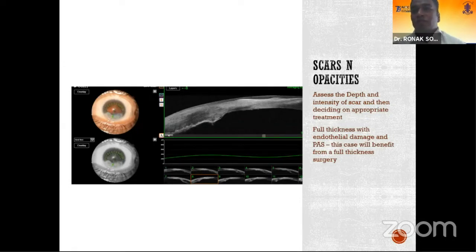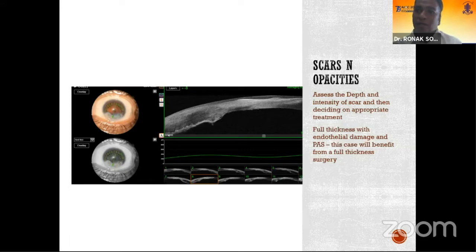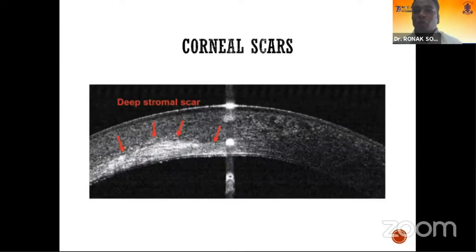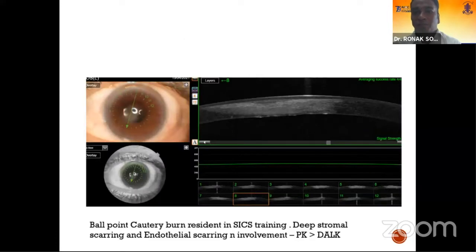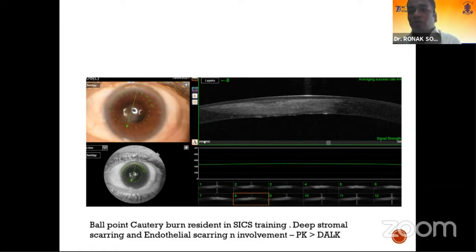For example, in this case you can see there is a full-thickness scar with involvement of the endothelium, so it is better to plan a penetrating graft rather than an endothelial keratoplasty. Depth of the stromal scar helps in assessment and treatment decisions — whether you want to do a DALK, superficial lamellar keratoplasty, or full-thickness keratoplasty. A case was referred where there was a ballpoint cautery burn during SICS training; on ASOCT, deep stromal scarring and endothelial involvement were seen, so penetrating keratoplasty was preferred over DALK despite a focal area of involvement.